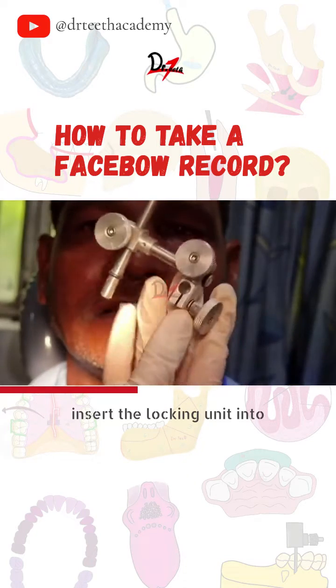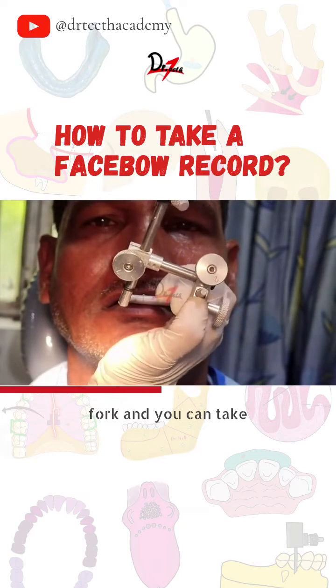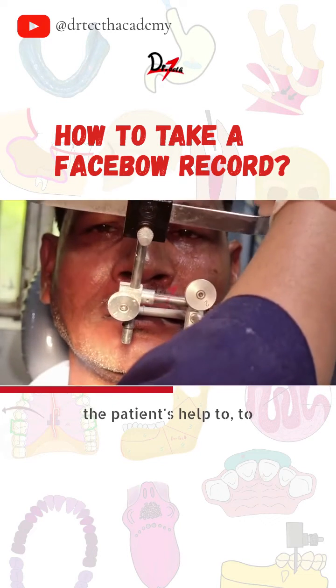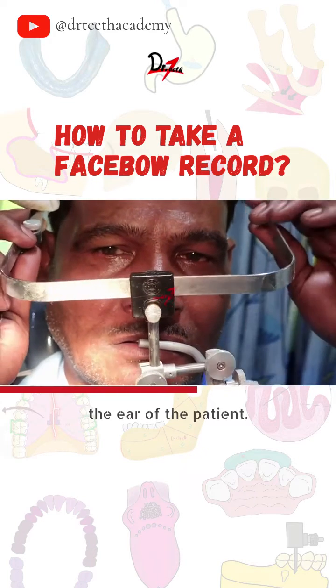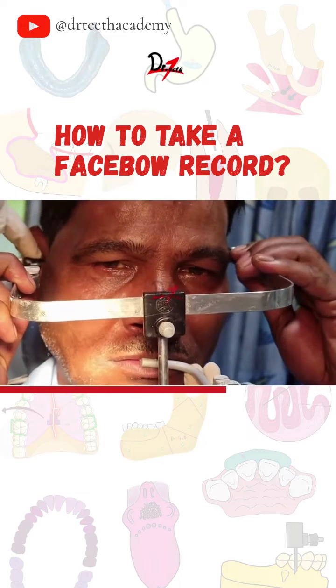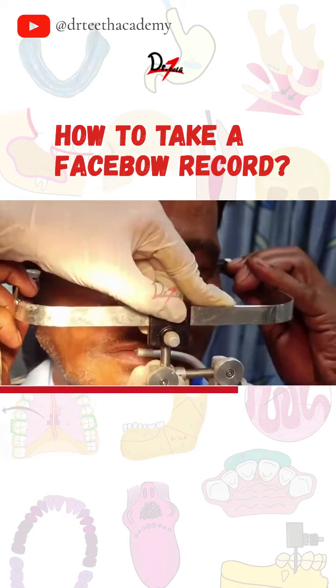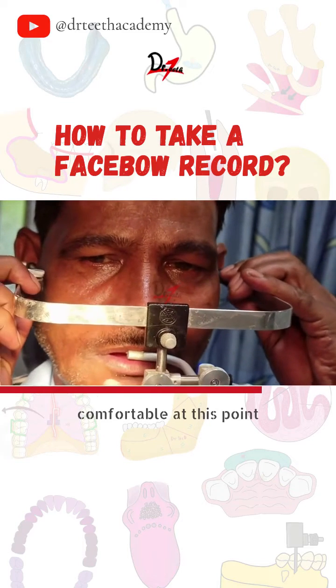Insert the locking unit into the stem of the edentulous fork. You can take the patient's help to insert the earpiece into the ear of the patient. Ask him whether he is comfortable at this point of time.